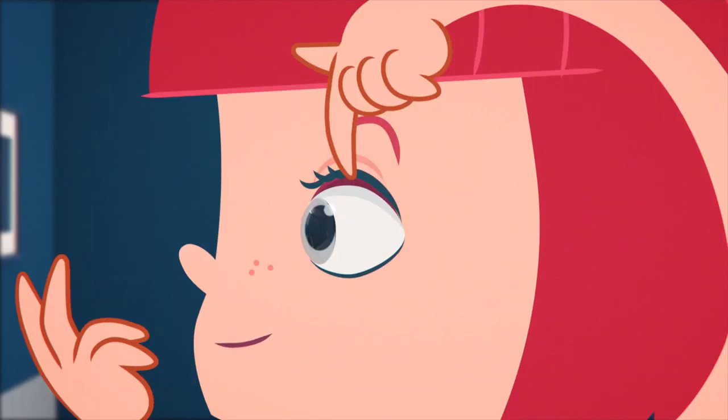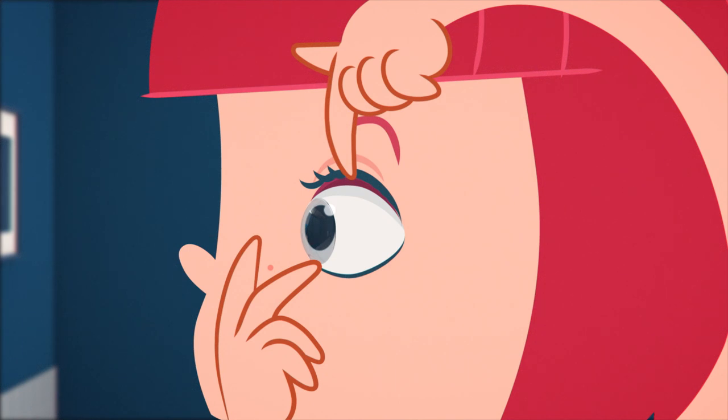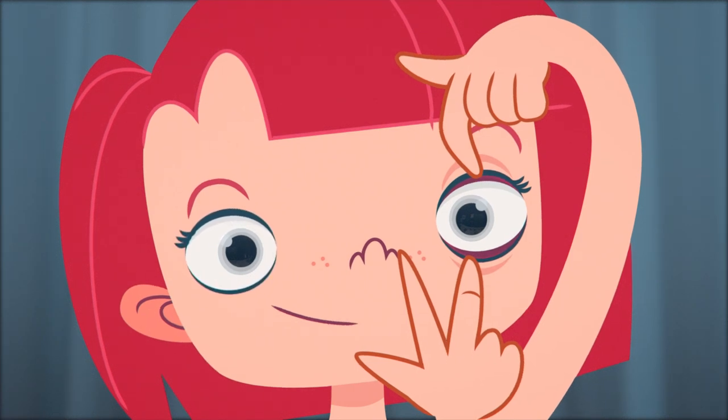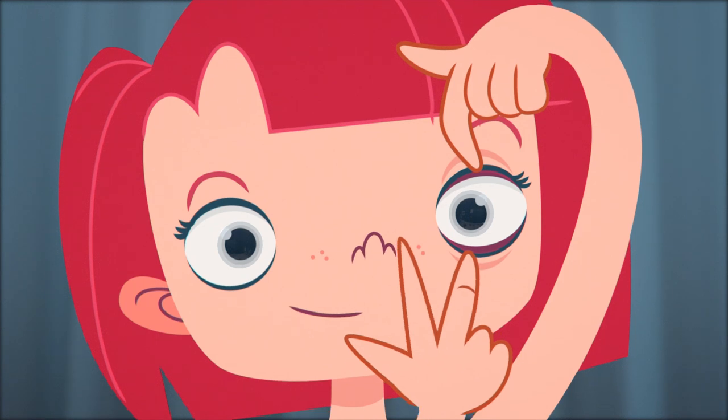Now take the middle finger of your other hand and press on the lower lashes. Just like you did with the upper lid, pull the lower lid down towards your cheek. Keep both of your eyes as wide open as possible and look straight ahead.